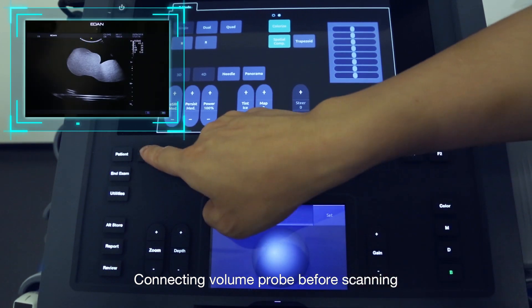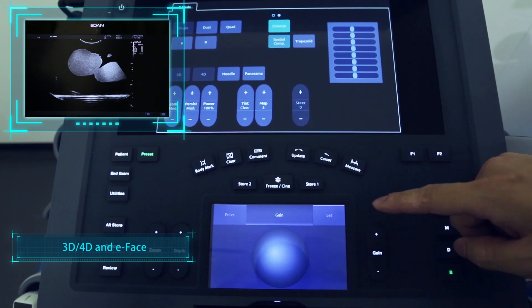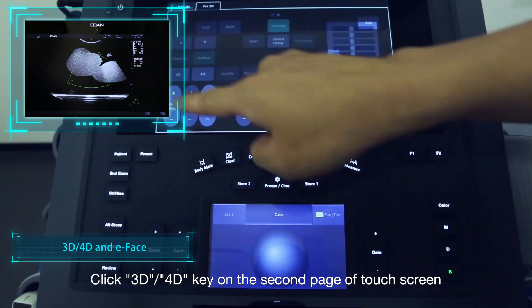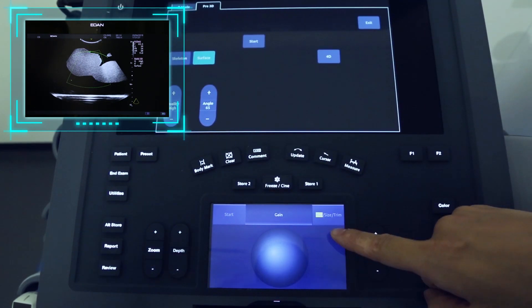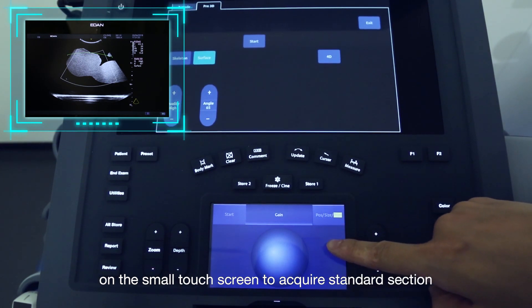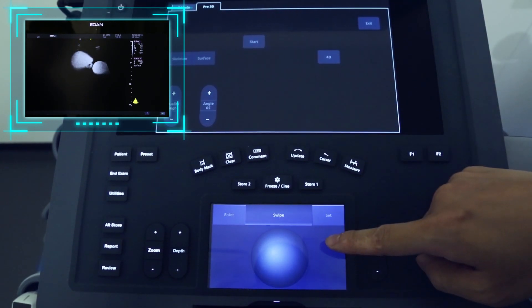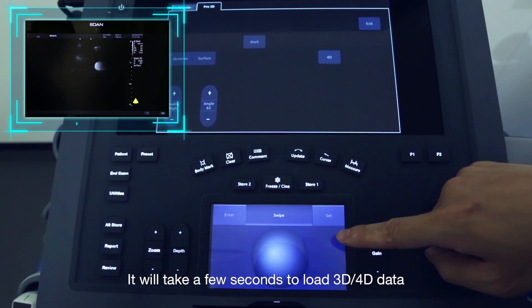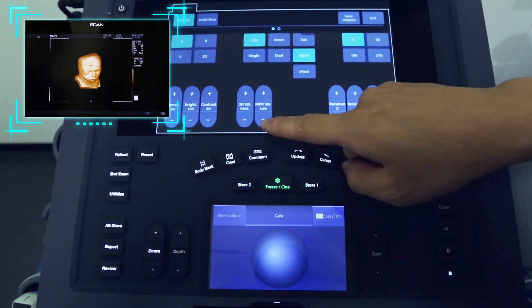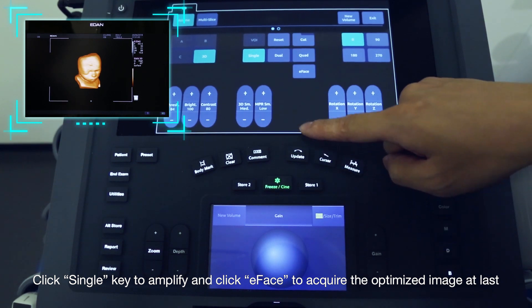Connect the Volume Pro before scanning. Click the Preset button and choose the proper presetting. Click the 3D or 4D key on the second page of the touchscreen. Adjust the sampling box by switching the Position, Size, and Trimming keys on the small touchscreen to acquire the standard section. Click Start to activate — it will take a few seconds to load the 3D or 4D data. Click the Single key to amplify and click E-phase to acquire the optimized image.